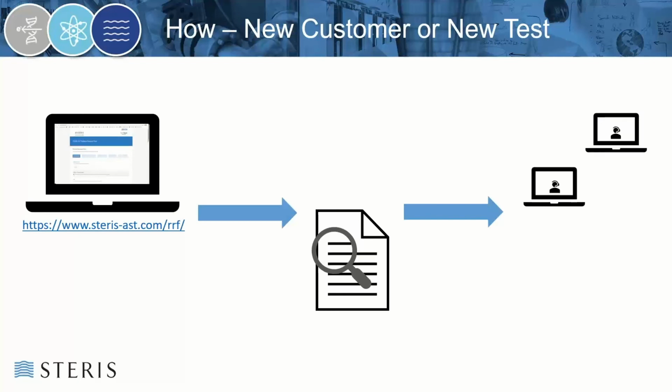Similarly, one thing that we do is, again, for very common tests such as dose audits and max dose, this is something that really is the bread and butter of what we do. So if there's any glaring potential mistakes, obviously we'll discuss that with you. If you submit something where the test type and the dose don't seem to quite add up, then of course we'll come back to you. We'll just ask the question.